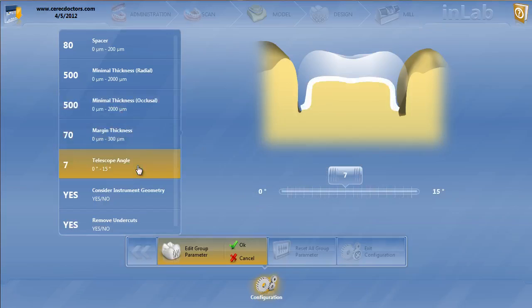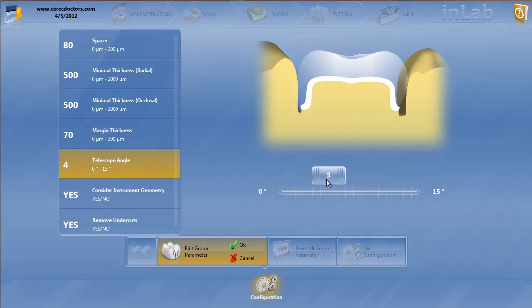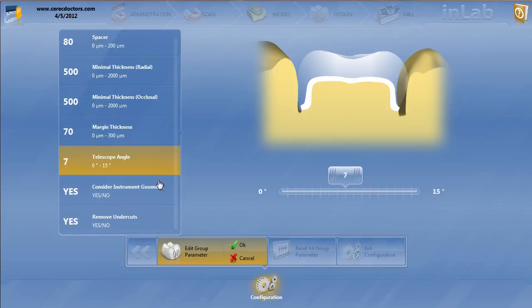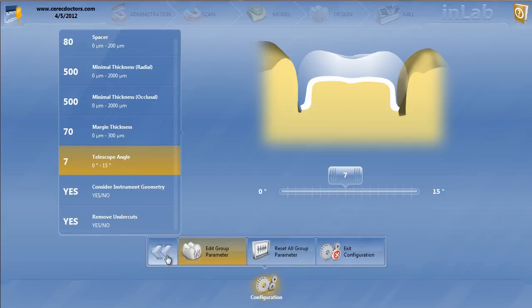Again, telescope angle is pretty important. You do not want a real low parallel telescope angle. I think I would keep this somewhere in the neighborhood of 7. And we know all about the geometry of the instruments and the undercuts. So that will be for the abutment frameworks.